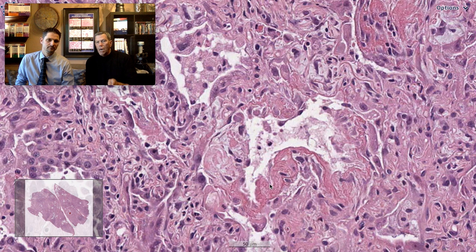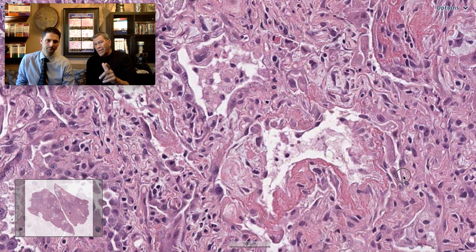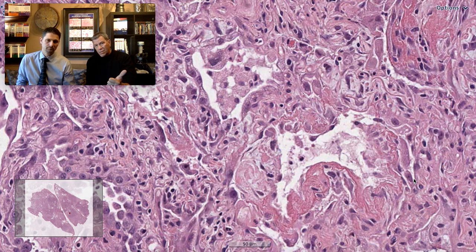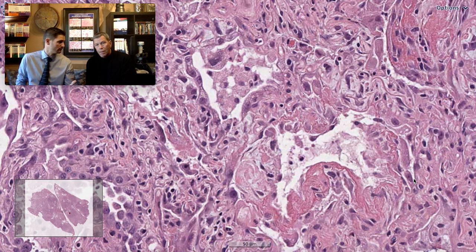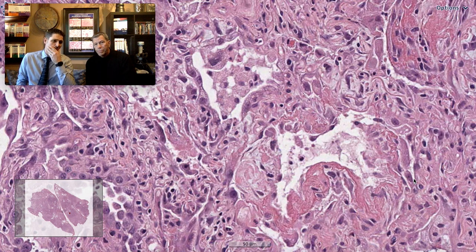So we're going to try to suggest possibilities. First, look for bugs — the patient's immunocompromised, better get bug stains: AFB, GMS. You might even do some exotic immunohistochemistry. They were negative on this case. Because you always do them when you have an acute lung injury.